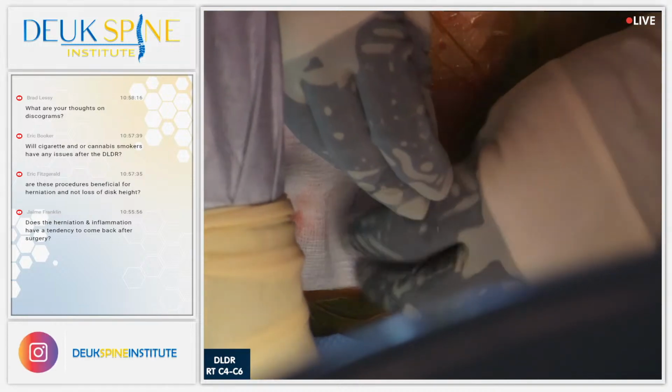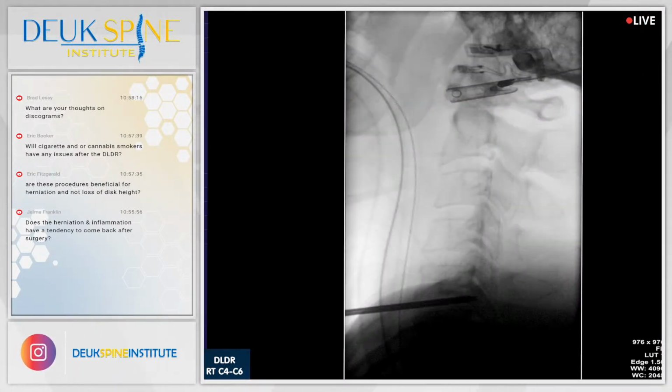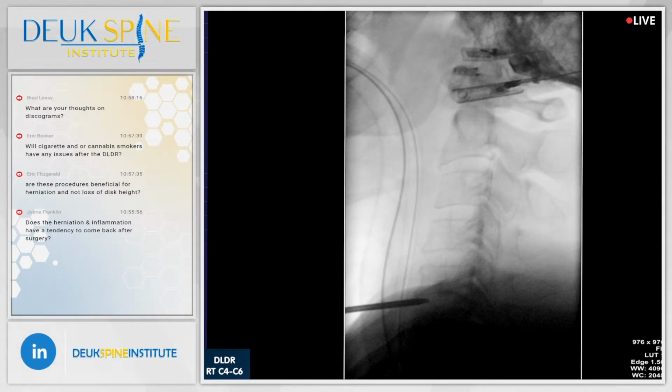Okay, coming out of this disc. So far we've lost 1 drop of blood. 1 drop. Oh, that's good. All right, here we go. I'm almost out, and I'm going to move up 1 disc. I just need to have full attention right now, so I'm sorry I won't take any questions for a few minutes, but I want to make sure we do this right.